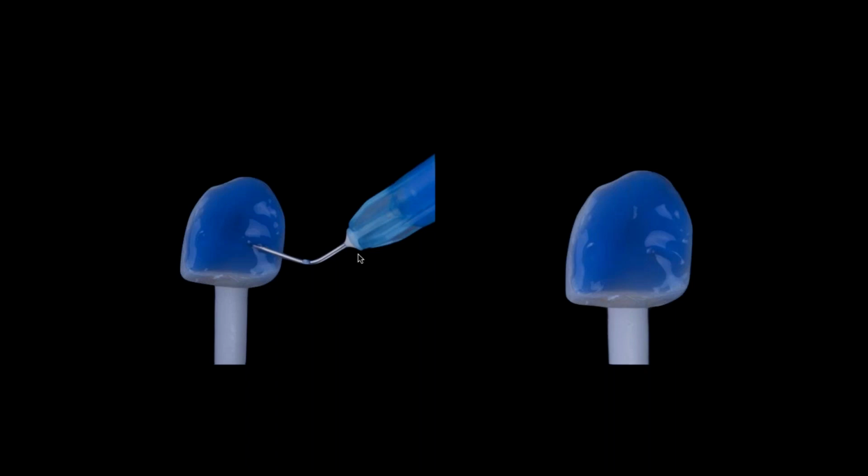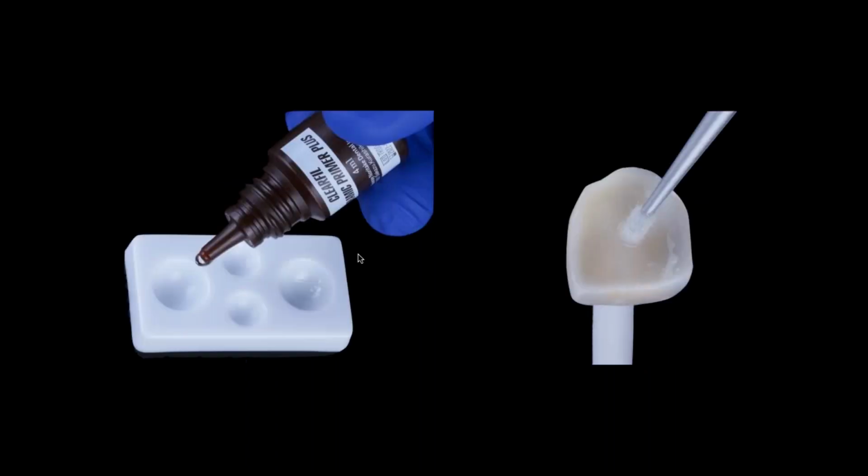And then we go ahead and apply a conventional silane, okay? Here, in this case, as I said before, we use the ceramic primer plus because it's a silane also, but you can use a conventional silane for this VITA Ambria material, okay? Once you place the silane, you don't want to let that restoration get contaminated. You don't want that restoration to get dirty or wet. It's ready for the next step, which would be the final adhesive cementation.